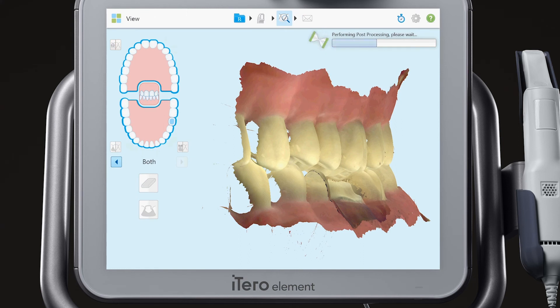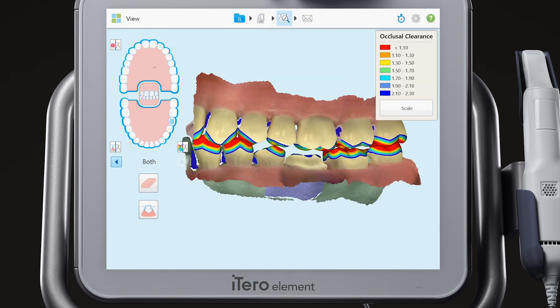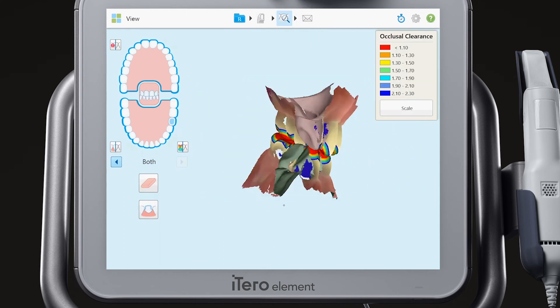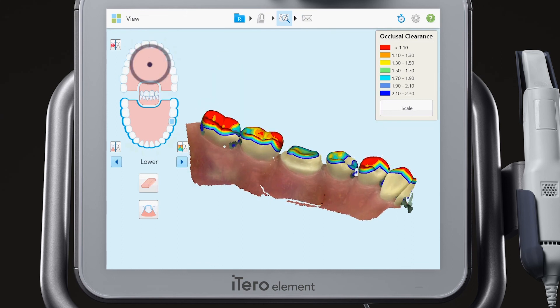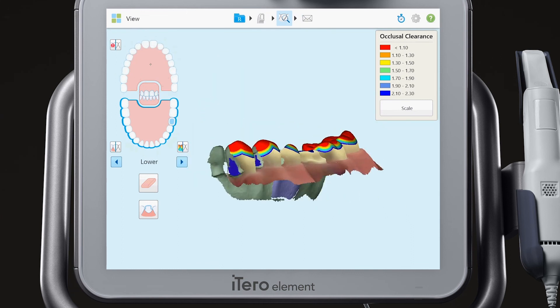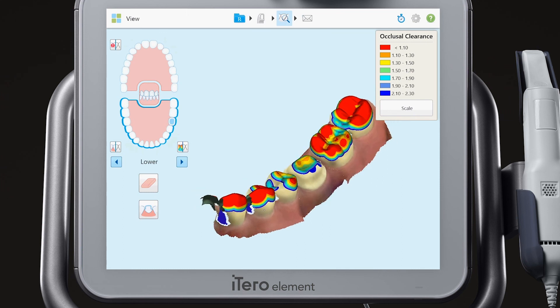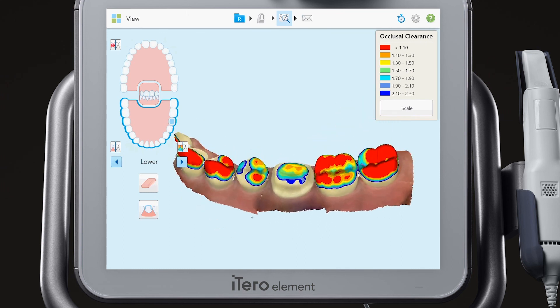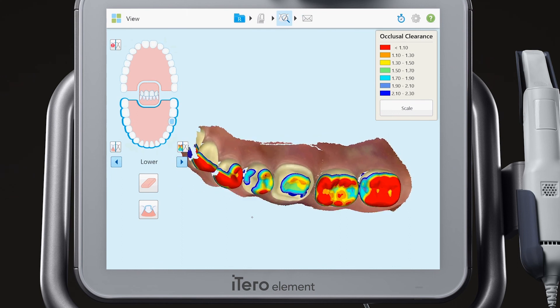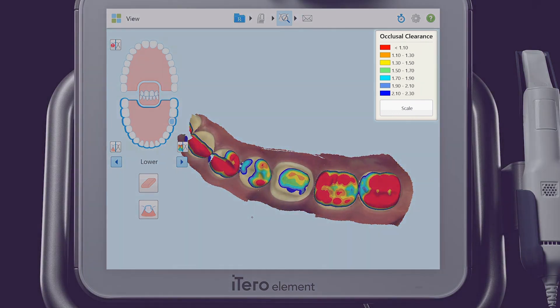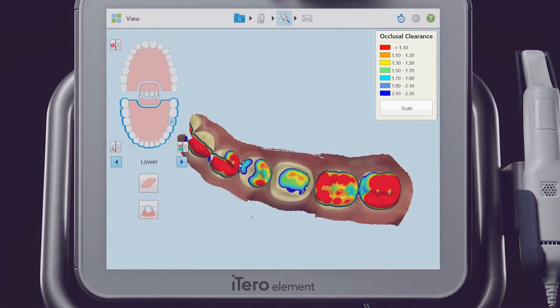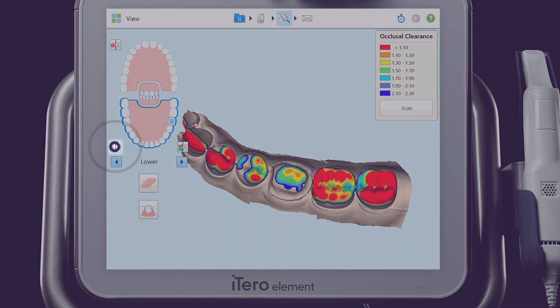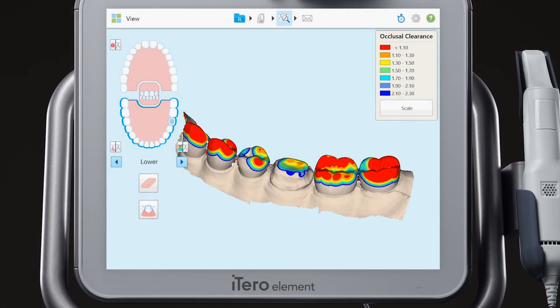When the case is processed, review the digital model to ensure the capture of complete anatomy. Review the bite with the opposing arch in place, then turn off the opposing arch. Review the prepped arch, including the capture of the contacts and the complete margin. Refer to the occlusal clearance color scale to ensure that your prep has adequate room for the chosen material type. Toggle between color and monochrome to appreciate additional detail.